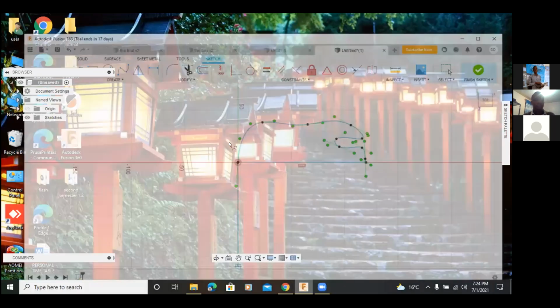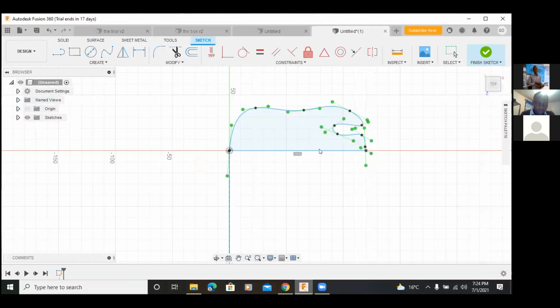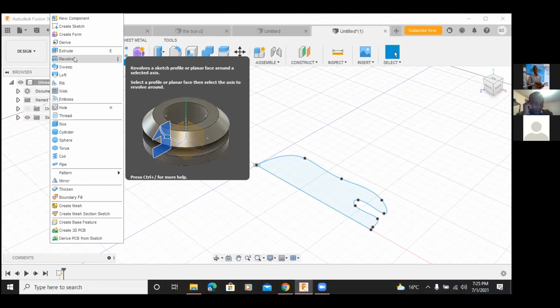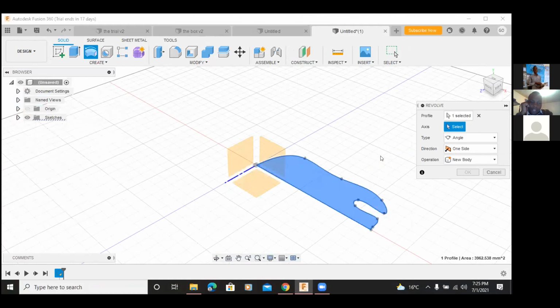Share Fusion. Finish sketch. E-line, okay. Finish sketch 1. Yeah. So create. Go to create, Revolve. Then click on that surface. Yes. Select profile. Then you select what you've drawn.